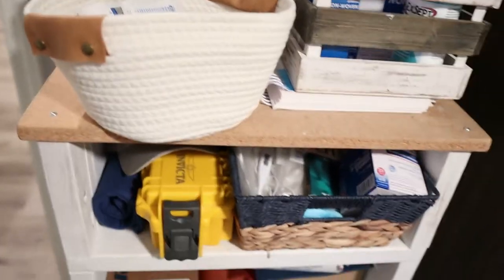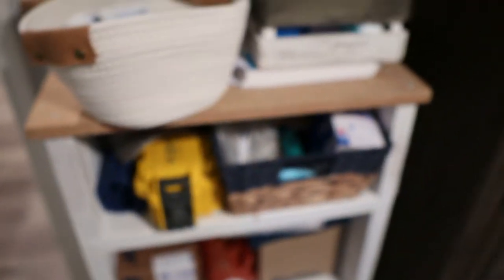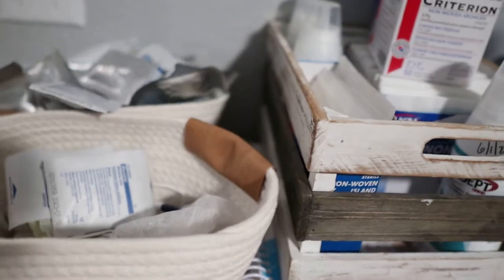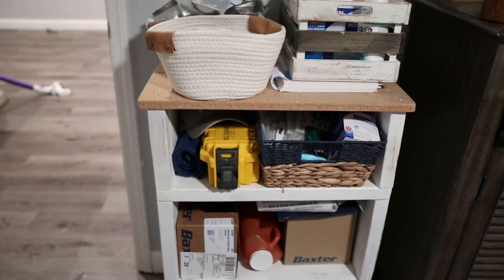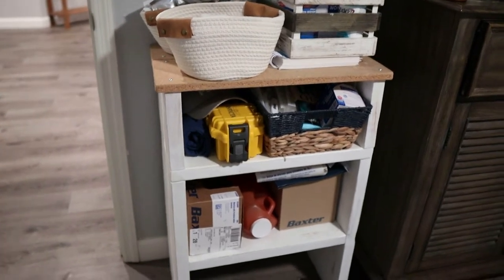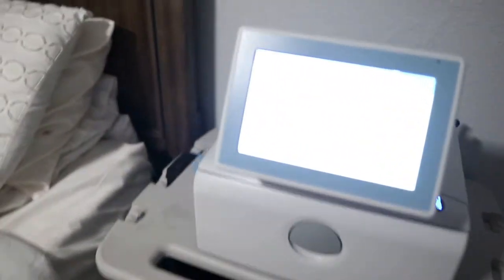While the machine turns on, I want to show you this shelf over here. Daniel actually built this a couple of years ago from extra furniture we had. Here are all his supplies — his caps, the solutions, bandages, and extra stuff. I have another video that's about half an hour long where I show how we organize all of Daniel's medical supplies, and I'll link that down below.